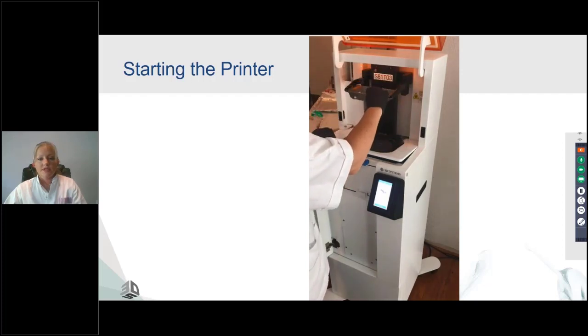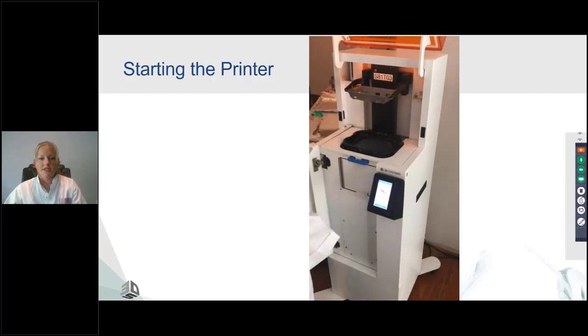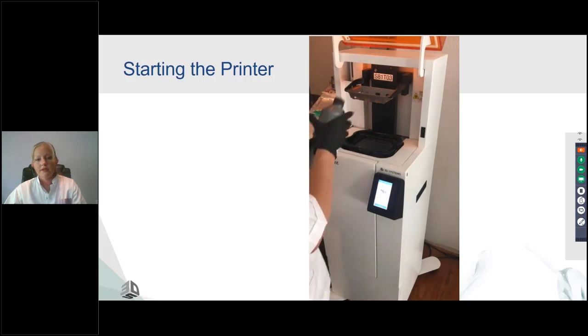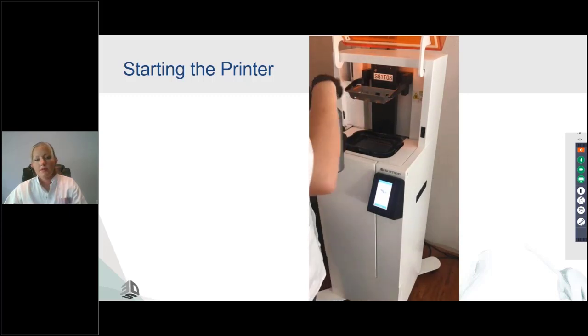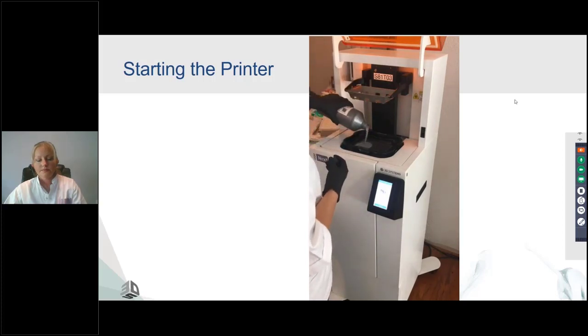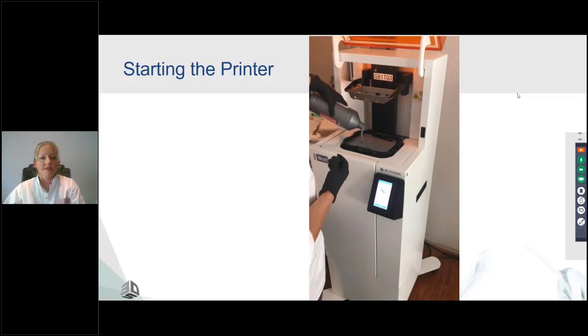And you can see those tension arms. I lower that down. Those adjust based on the tension of the membrane. I have my material rolling. I'm going to print models here. So I'll just go ahead and pour that material in. Now initially you roll it for a while, like 2 hours. But after that, once you pour it in the tray, you'll just mix the material when you're ready to print again. It can sit in there for like 2 months.